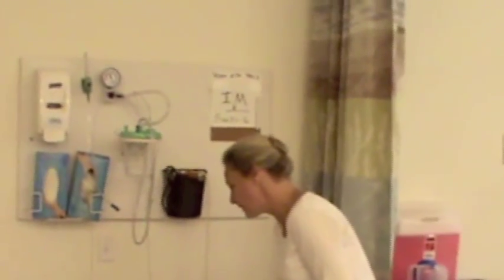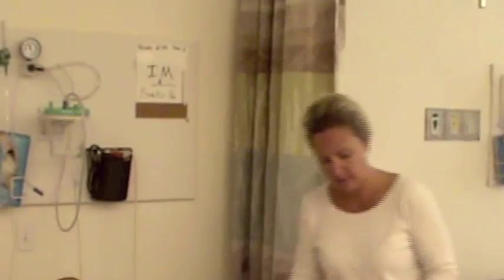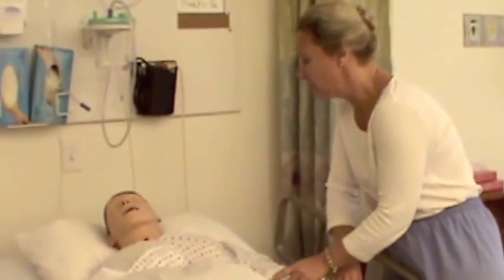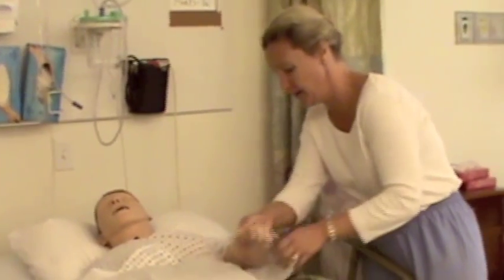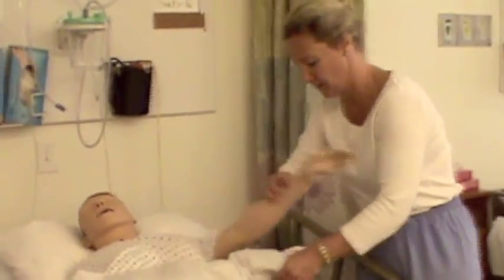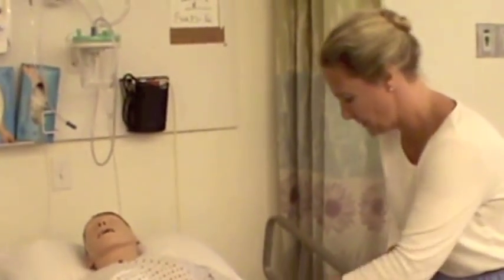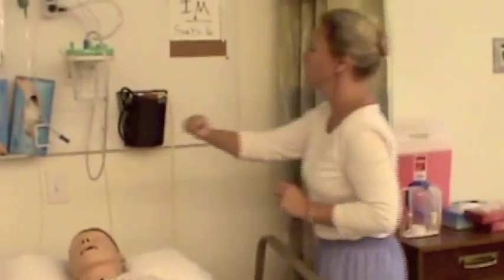Okay. Do you have any questions for me before I start? No. Just make it quick. Okay, I'll try. Okay, so I'm going to have you turn to your side if you can. Okay, so he's turning. And I'm going to get my gloves.